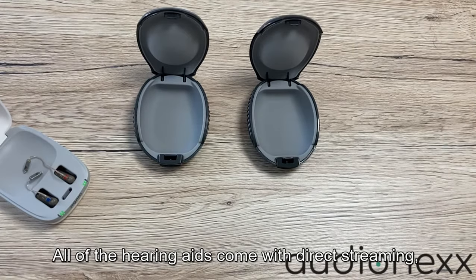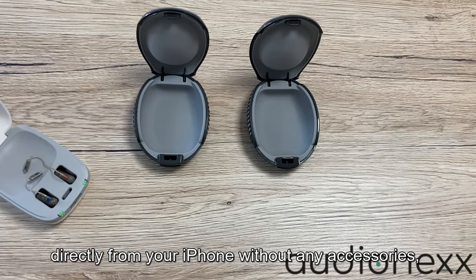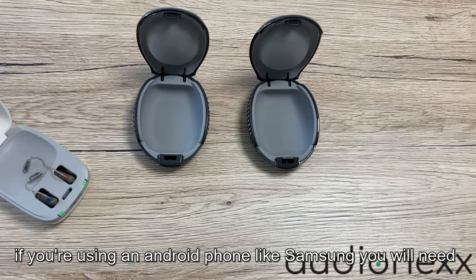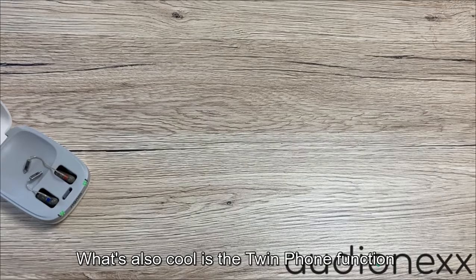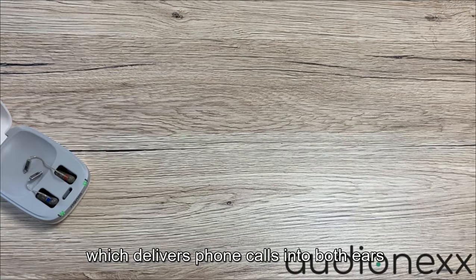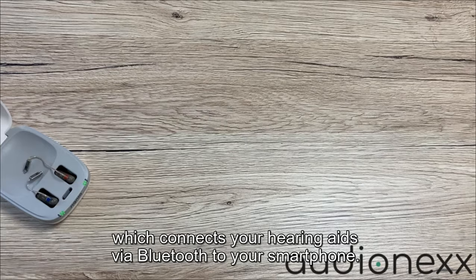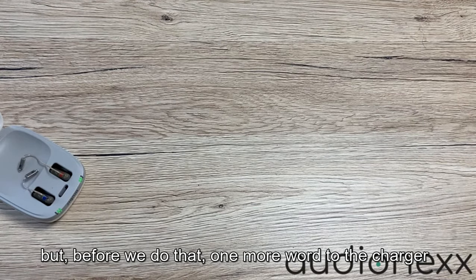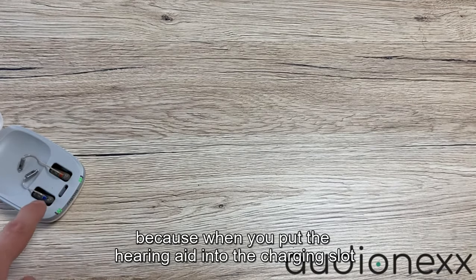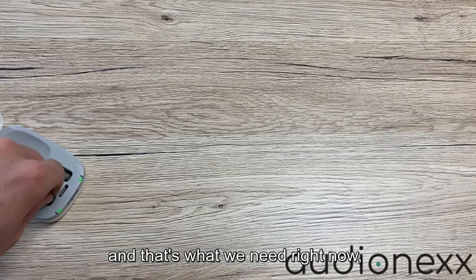All of the hearing aids come with direct streaming — you can stream music and phone calls directly from your iPhone without any accessories. If you're using an Android phone like Samsung, you will need an accessory for phone call streaming. Also cool is the twin phone function, which delivers phone calls into both ears. We also have the Signia app which connects the hearing aids via Bluetooth to your smartphone. One more thing about the charger: when you put the hearing aid into the charging slot it turns off automatically, and when you take it out it turns on automatically.